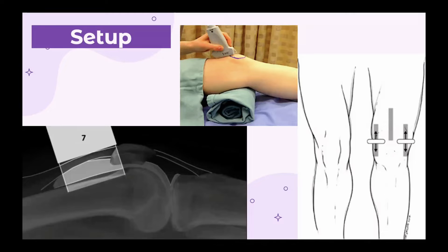For patient setup, the patient would be supine and you place something such as a towel or cloth beneath their knee to raise it and create a 30-degree flexion at the knee. These are the areas where you would place the probe, with the indicator pointing upwards. You start with the longitudinal view and then begin identifying structures.